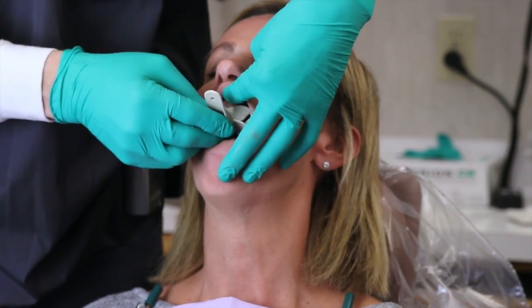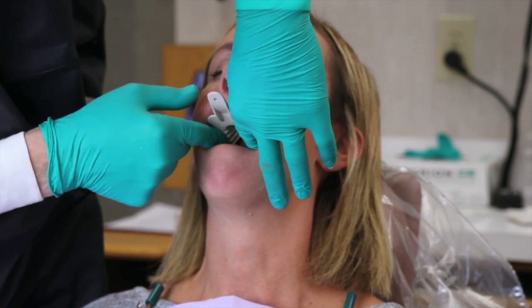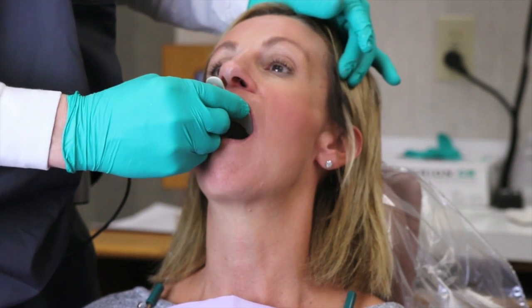And relax your upper lip over that. Making sure we have adequate coverage, which looks good. And I can feel with the tray, you have a little bit of room there. So that feels good. So I think we have good sized trays.